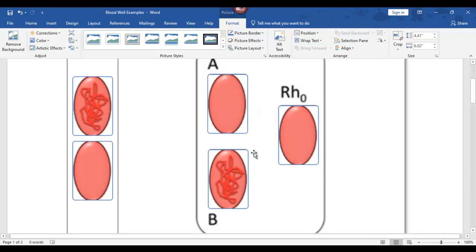You put your blood in each well. In this well with the A, you're going to drop A antibodies. This represents the Rh factor, or the antigen D. You would drop Rh antibodies in here, the anti-Rh antibodies. And then in this well, you're going to drop B antibodies. If your blood has whatever antigen, there's going to be clumping, or what is called agglutination. In this case, see that clumped? That means that this person is B negative. They don't have the Rh factor and they don't have A, because there's no clumping here and you see clumping there.